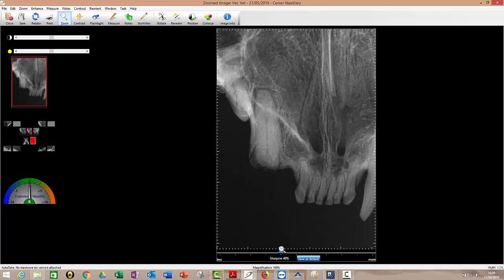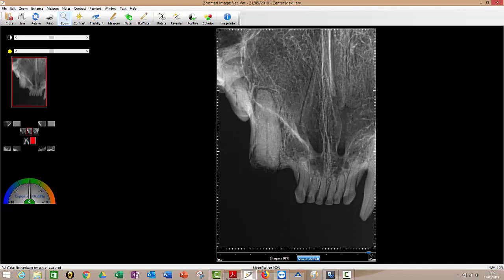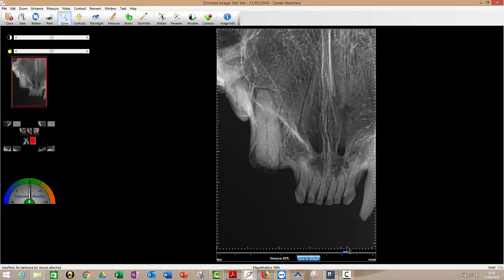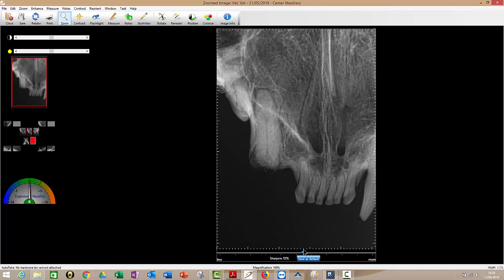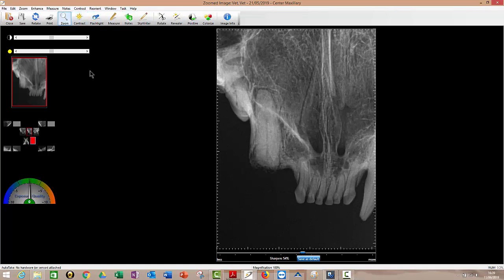So this image here, see this little blue thing here under the image. If I just left mouse click and move that over to the right, you see the image sharpening up and softening. So sharper one way, softer the other. That's how that goes. It's just a quick way of sharpening the image.